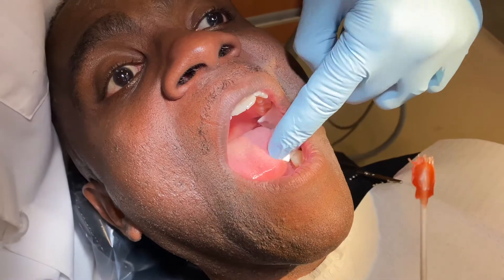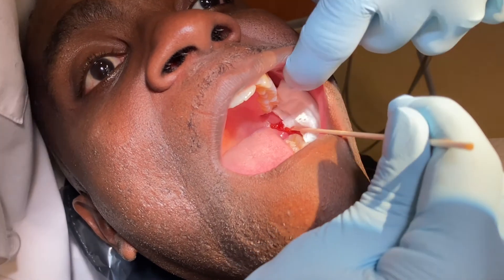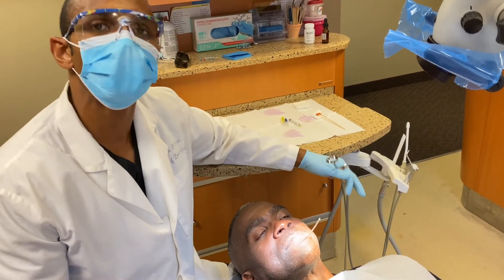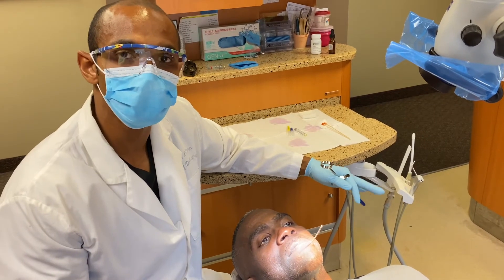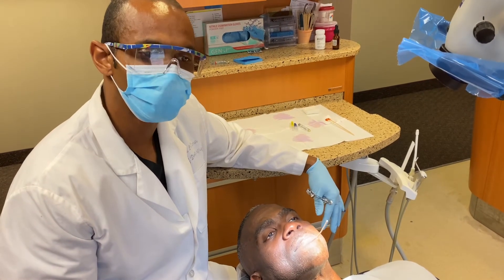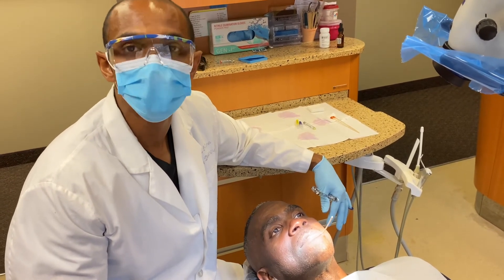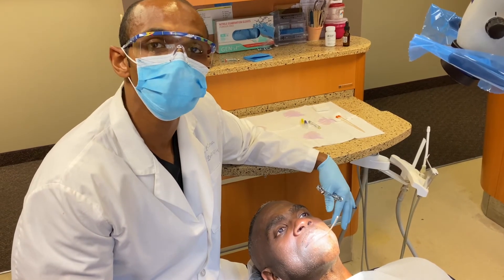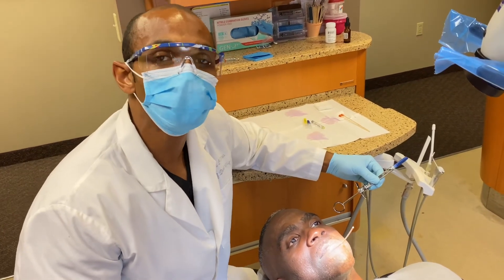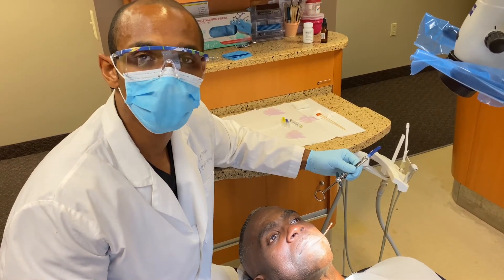First, I'm going to dry Dr. Bevelle's tissue in the triangle area, leave my gauze there, and have Dr. Bevelle close down for me. Typically you can leave the topical there anywhere from five to eight minutes — the longer you leave it, the less the patient will feel the injection. I'm using carbocaine here because we don't want Dr. Bevelle to be numb all afternoon, but if you want longer lasting anesthetic for a patient, I would recommend bupivacaine or marcaine.